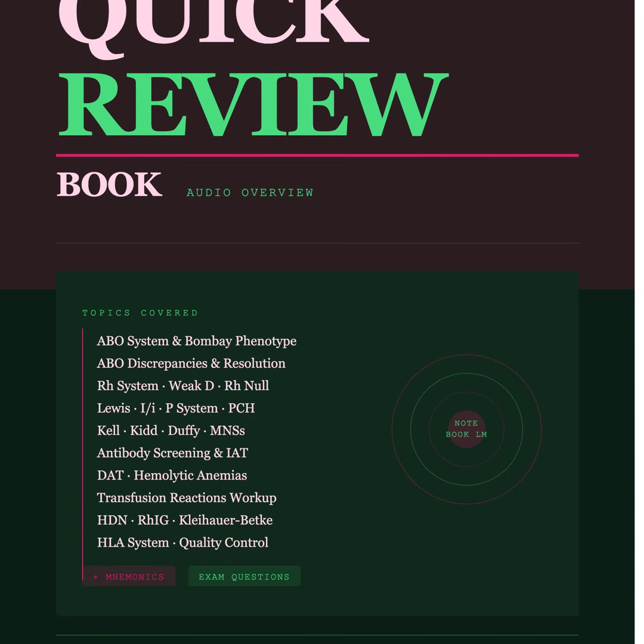The other critical exam fact for the MNS system involves their physical interaction with our laboratory enhancement media. Specifically, the study guide highlights a mnemonic involving enzymes. Ficin, the lumberjack. What does the lumberjack do to M and N? The lumberjack chops them down. Chops them down. The M and N antigens are physically located on the outer edge of a glycoprotein called glycophorin A. They're very exposed. Okay. If you treat those red cells with routine blood bank proteolytic enzymes like ficin, papain, or bromelain, those enzymes act like chemical machetes. They literally cleave the glycoprotein, completely chopping off the M and N antigens. So if you test enzyme-treated cells with anti-M or anti-N, you will get a completely negative reaction because the targets have been destroyed. Exactly.